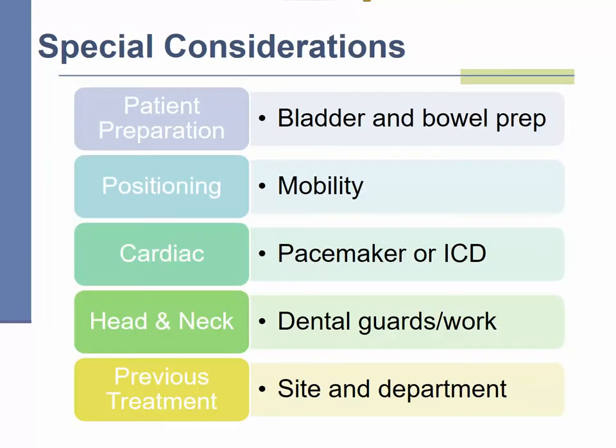There are some special considerations we need to keep in mind for patients that are going to be undergoing radiation therapy. To start off with, we rely heavily on the information provided in the RT request questionnaire, as it typically shares special considerations that must be thought of for the CT sim and during the planning process. If this information is not provided or collected prior to their CT sim, treatment can often be delayed and/or compromised.